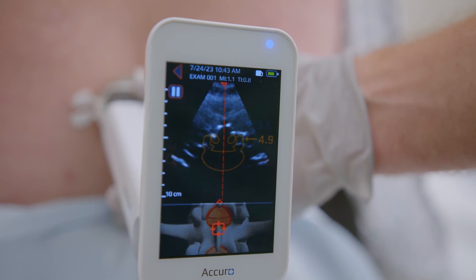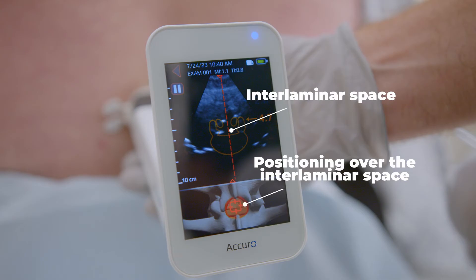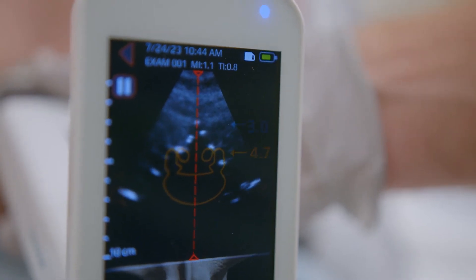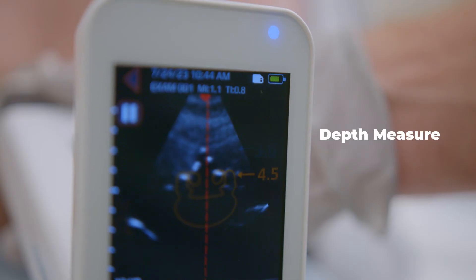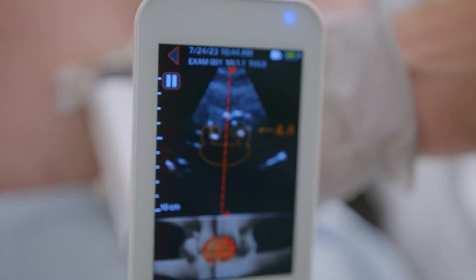Scan slowly, vertically, to identify the interlaminar space. When the orange overlay is displayed, you have found the interlaminar space. Please note that pressure while scanning can compress tissue and cause the depth measurements to be underestimated. For more accurate depth measures, release pressure against the skin prior to noting the depth measure.